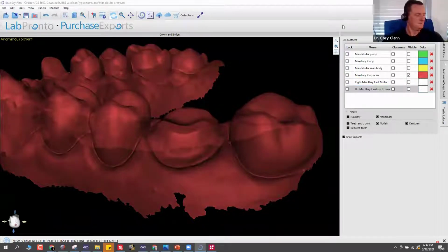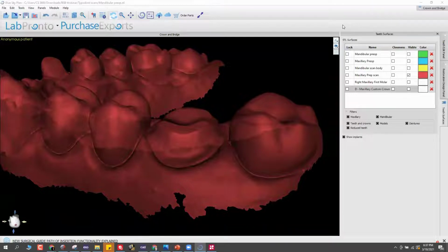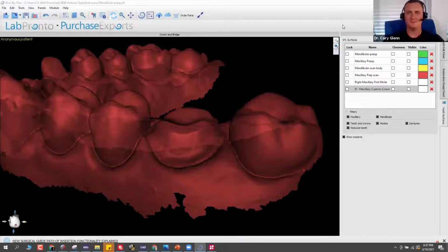Okay. First comment question, my mind is blown right now. I'm already thinking of ways to use this to make in-house flippers with tooth color contacts and then pink with clasps and use resin to connect it to. Is this possible? Everything's possible. So yeah, you can do that.